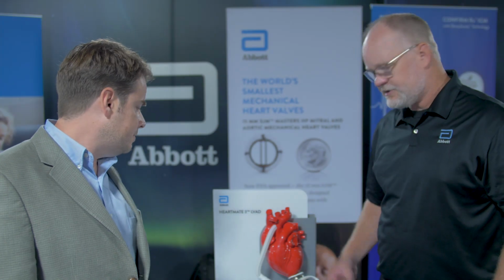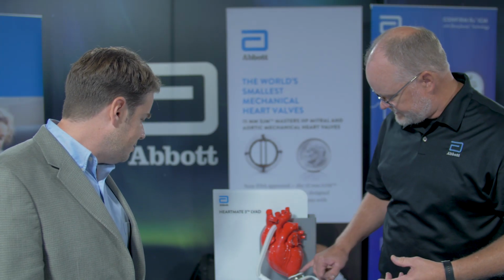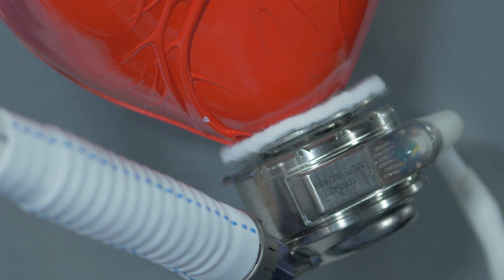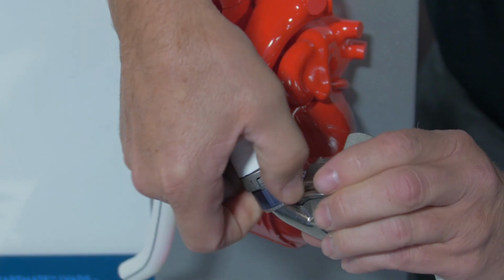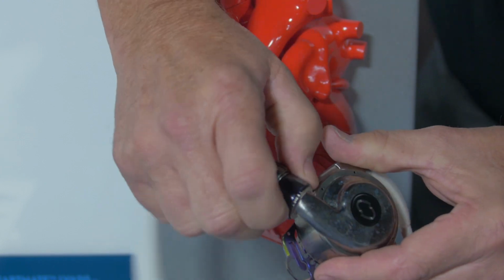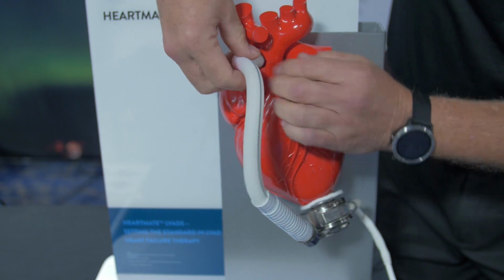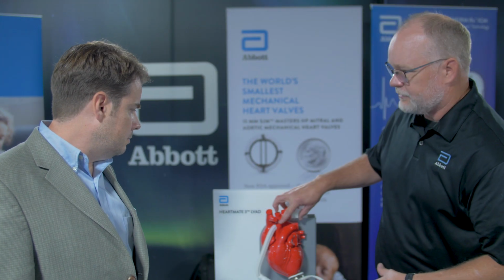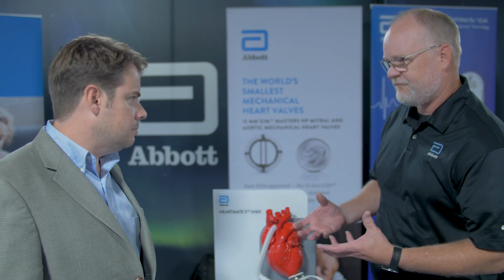Yeah, some of the features is the mag lev pump that's actually inside of this piece here. The outside motor mechanisms are there, and this is a drive cable that connects to the controller and the battery. Inside here is the pump impeller that's suspended by a magnetic levitation, and it's the only piece that's in contact with the blood. And then it pumps from the ventricle through this tube back into the aorta, giving oxygenated blood back to the body, since the ventricle's not functioning as well.